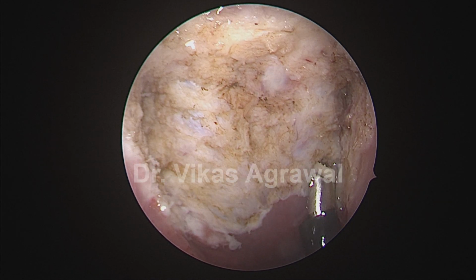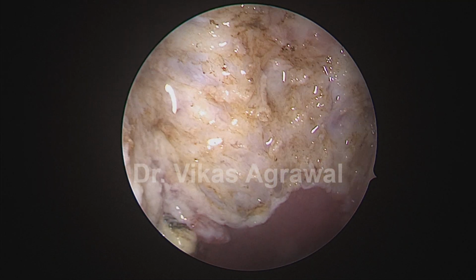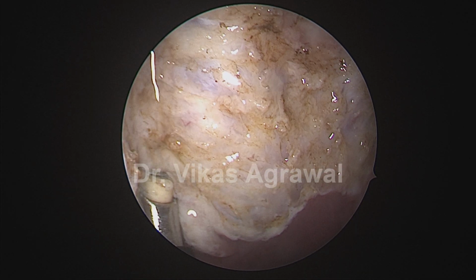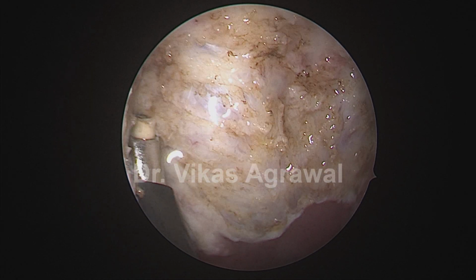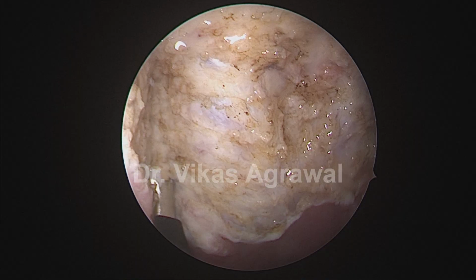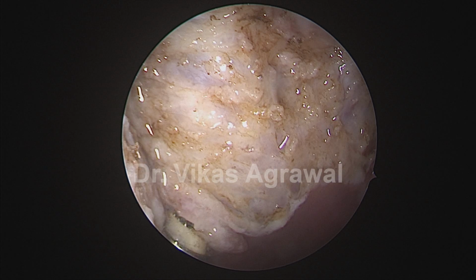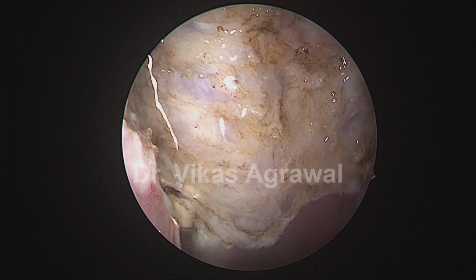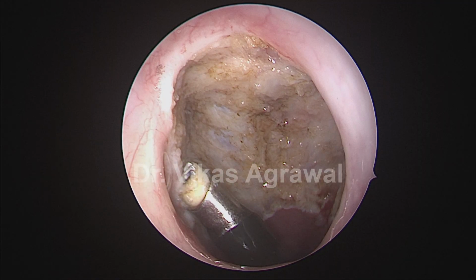So in the extreme areas and lateral areas, if you do not want to ablate this, you can simply coagulate. In the depths, if you are not sure, you may simply coagulate so that this tissue will never hypertrophy. It will get fibrosed. Obviously, it's not as good as ablating, but I am ablating here, and I just showed that you can also leave behind some tissues after coagulation.